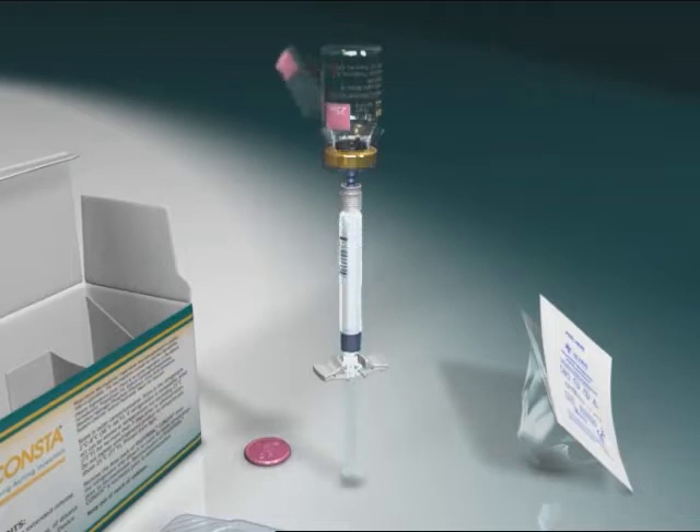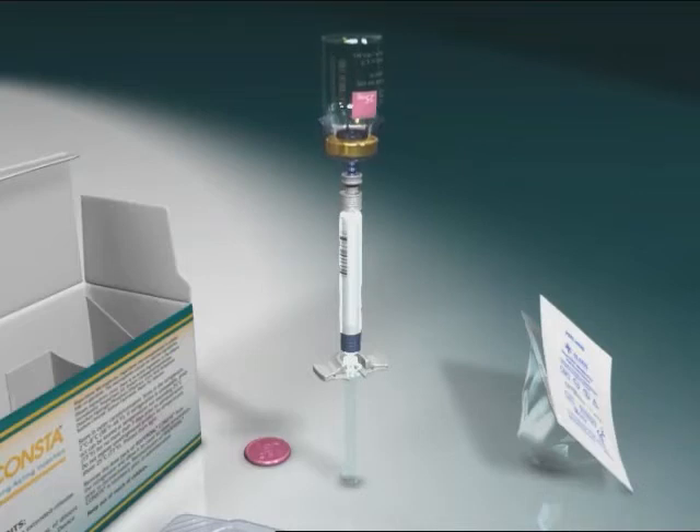Tear the vial label at the perforation and apply the detached label to the syringe for identification purposes. While holding the white collar of the syringe, unscrew the syringe from the SmartSight access device. Discard both the vial and SmartSight access device appropriately.